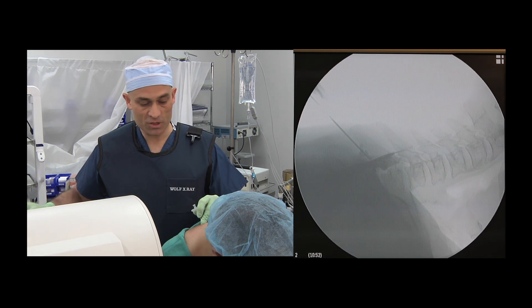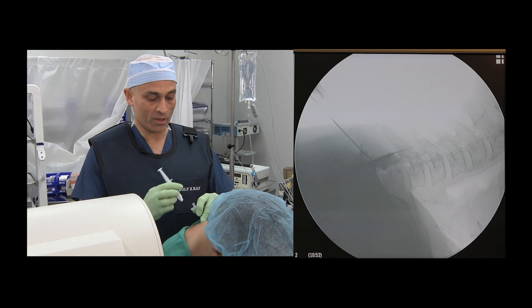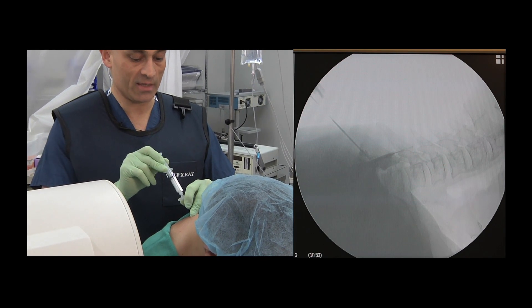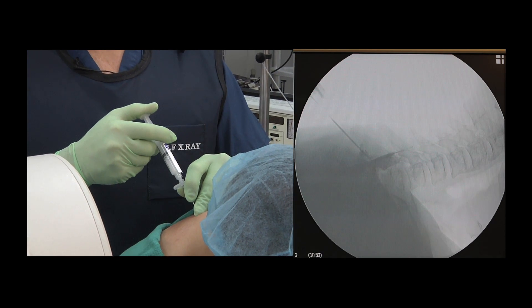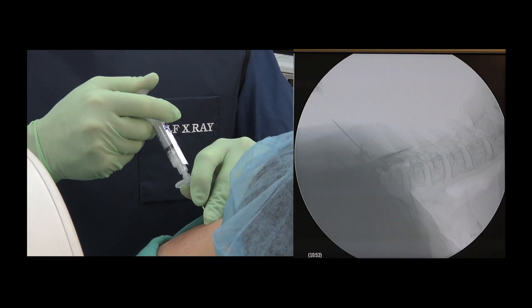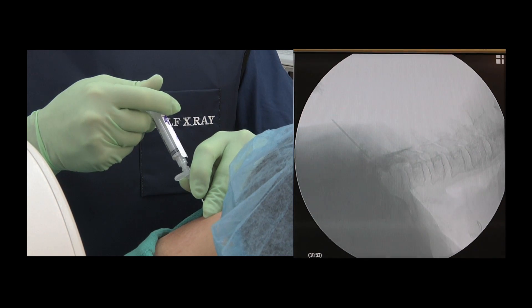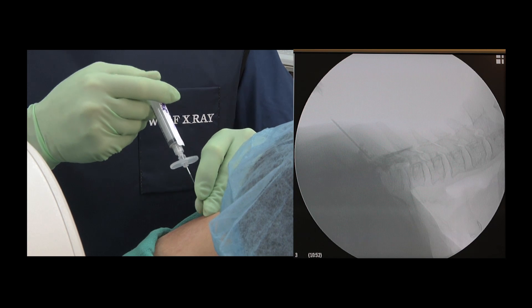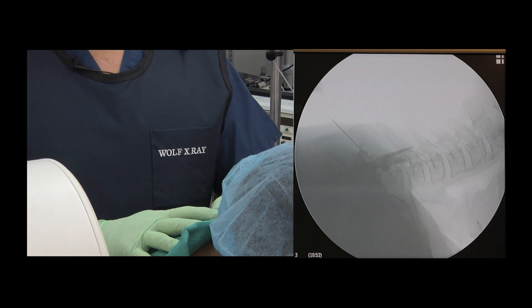The therapeutic solution, which contains Depo-Medrol, the anti-inflammatory, with a local anaesthetic, is then attached to the needle and is advanced slowly under fluoroscopic guidance into the epidural space. The medicine will act as an anti-inflammatory, reducing pain in the patient's neck and arm. The needle is withdrawn from the patient's neck, and this concludes the procedure.